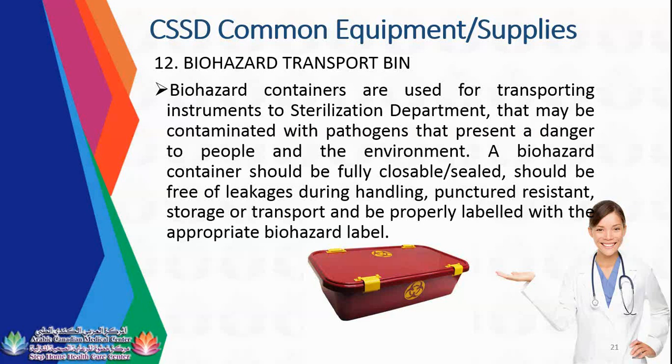So guys, there are two protocols in getting the instruments. It's either the CSSD technician will get the instruments, or the nurse will send the instruments to CSSD, the decontamination room. So it depends. It's either the nurse will send the soiled instruments to CSSD, or the CSSD technician will take the instruments from the pickup point.